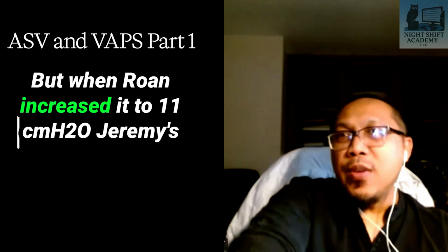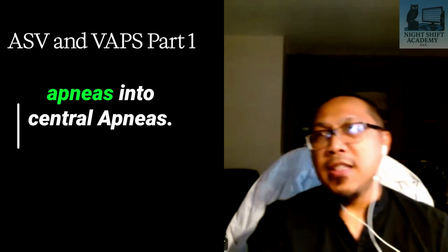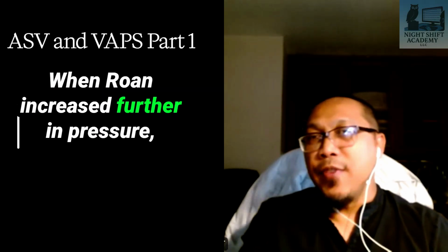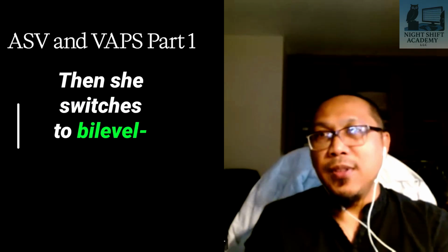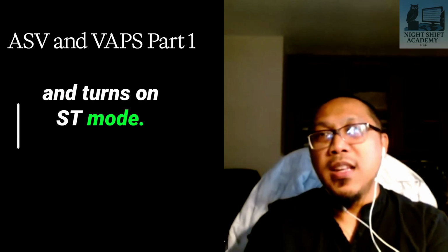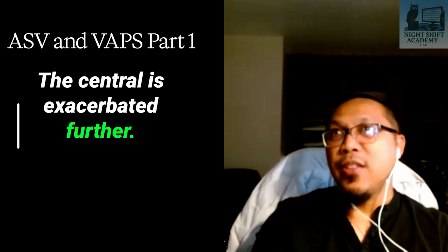But when Rowan increased it to 11, Jeremy's events now turn from obstructive apneas into central apneas. And when Rowan increased further in pressure, the central apneas just became longer in duration. Then she switches to bi-level, 8/4. Starts to increase pressure, central apneas start to increase and became longer and longer. She now switches and turns on ST mode. Same thing happens. The central is exacerbated further.